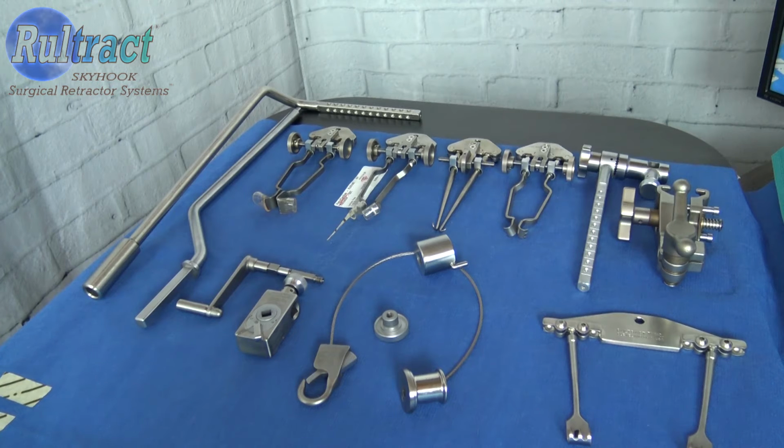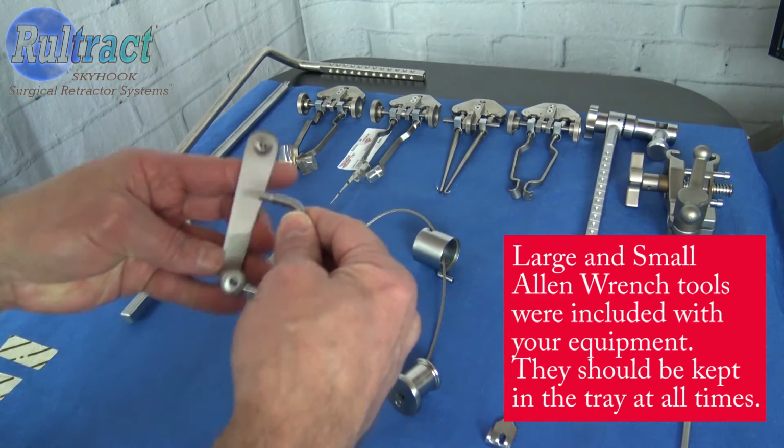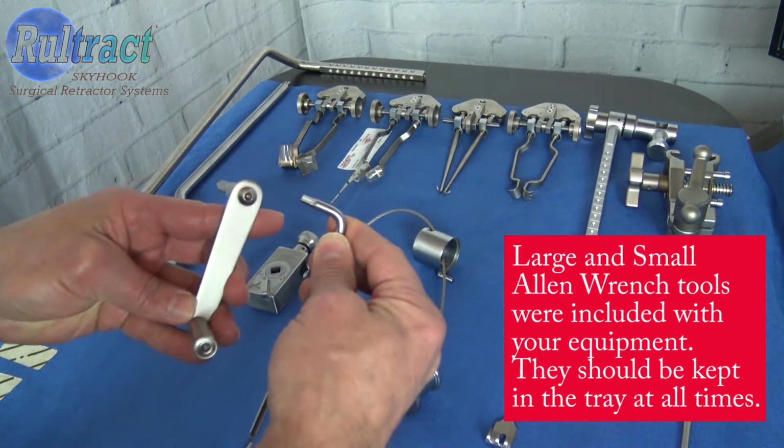Following the completion of the cleaning cycle, we are now ready to reassemble the Rultract ratchet rake assembly, check the position of all knobs, and check the tightness of all fasteners and screws prior to sterilization. The first thing that you're going to want to do is to check the screws in your crank handle using your large Allen wrench.